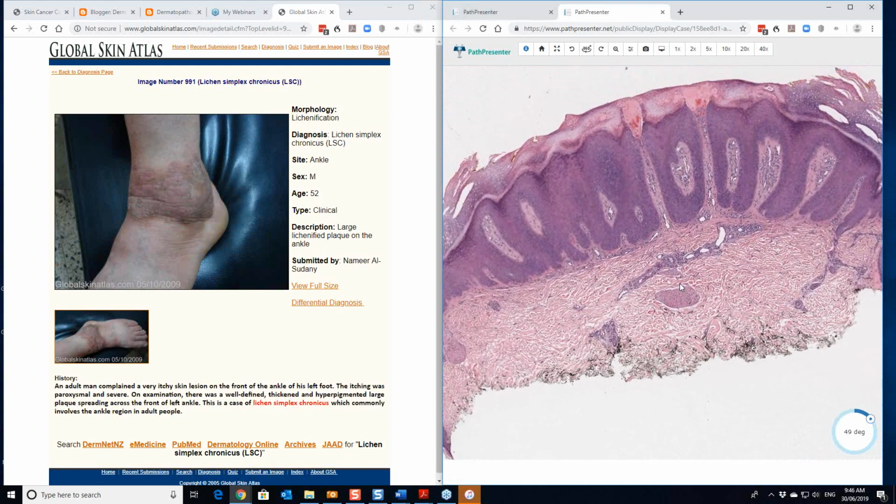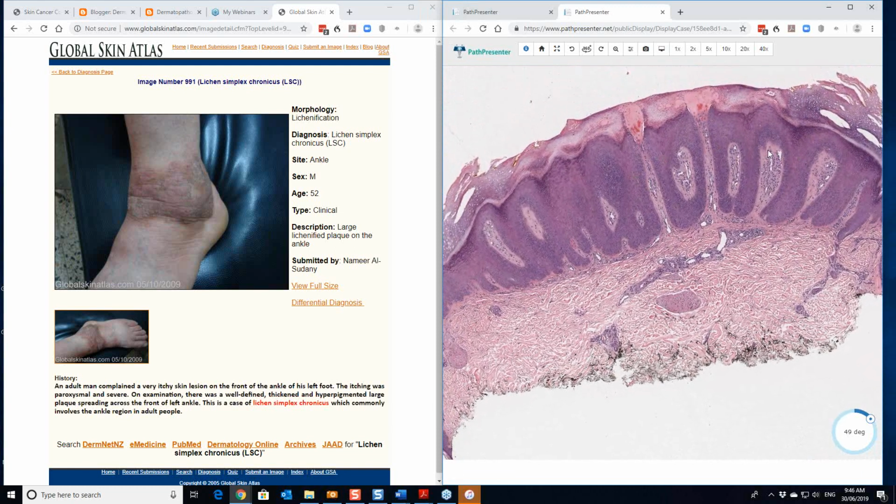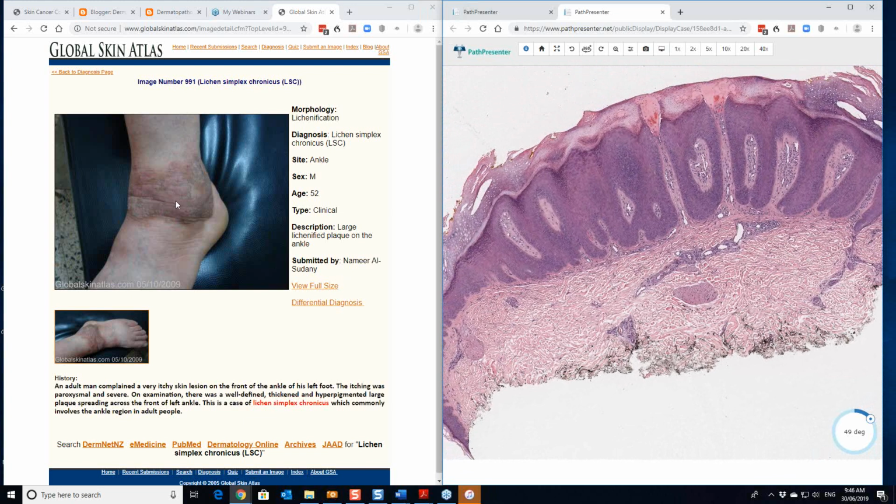the first thing is, though it's a form of eczema, there isn't a great deal of spongiosis here. You only get spongiosis really in acute eczema. You don't get it in chronic lichenified eczema like this. There is acanthosis. It does have blunt edges to the rete ridges. They do join together as well. There generally is a thicker suprapapillary plate in lichen simplex chronicus. There's also laying down of vertical collagen in the dermal papillae here.